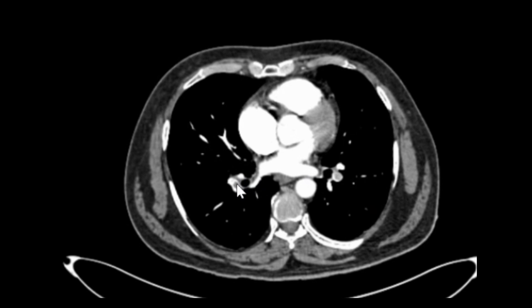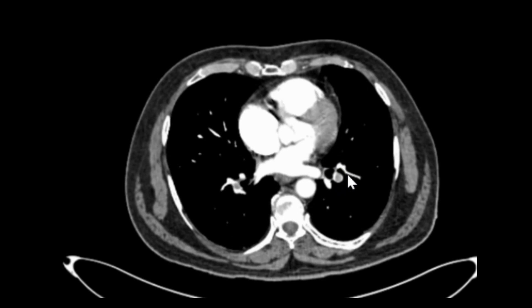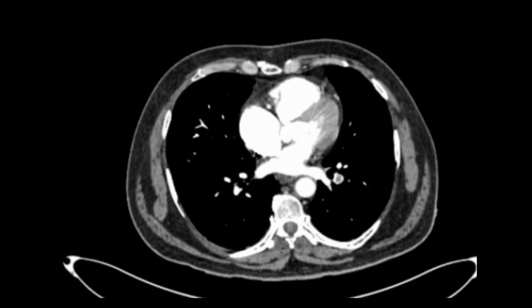Now we can see the filling defect surrounded by contrast. This is nothing but a partially filling thrombus in this vessel. We can see contrast surrounding the partially filling thrombi — it's called the polo mint sign, described for pulmonary thromboembolism on contrast CT.